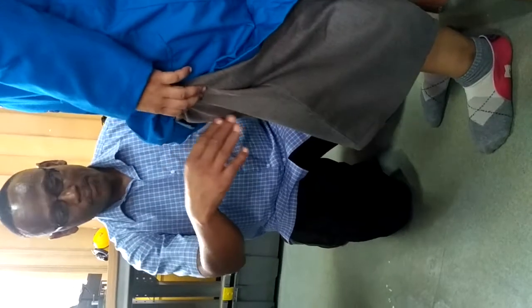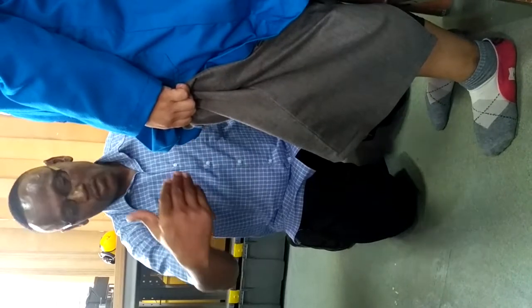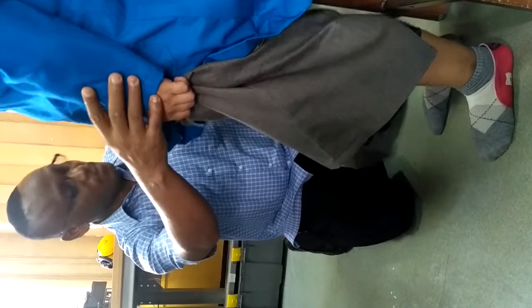After that, I am going to do static — stand up. Ask the patient to stand up, and then ask the patient about the feeling. Do you feel discomfort? You can also check the alignment from the coronal plane and also from the sagittal plane. If this is done, you will ask the patient to sit down. So sitting is done.